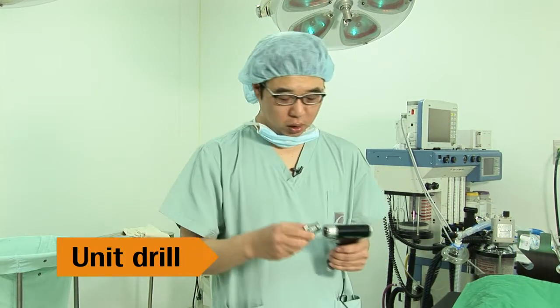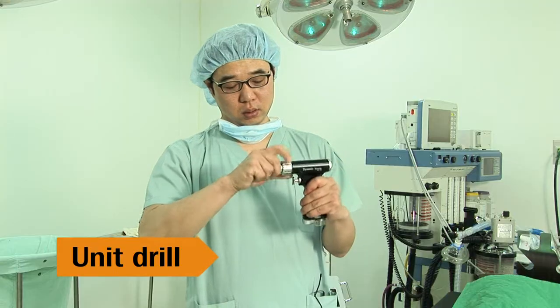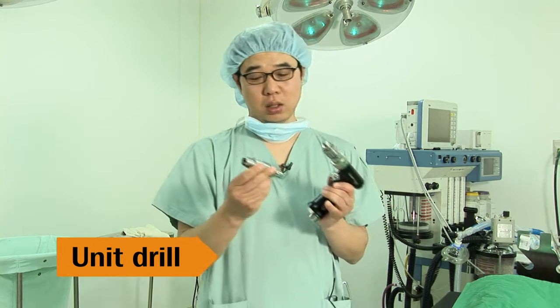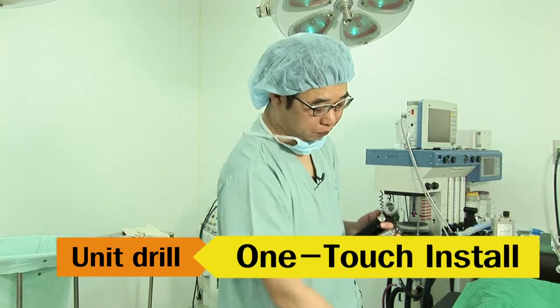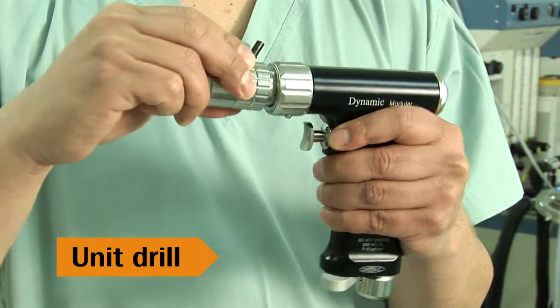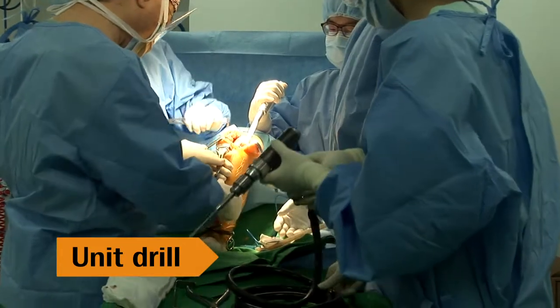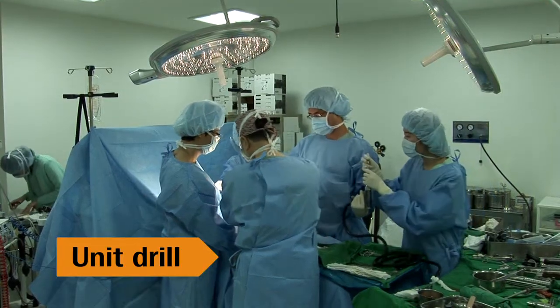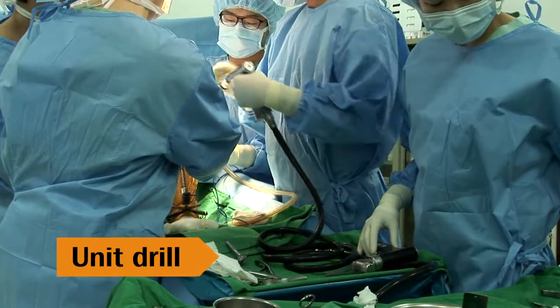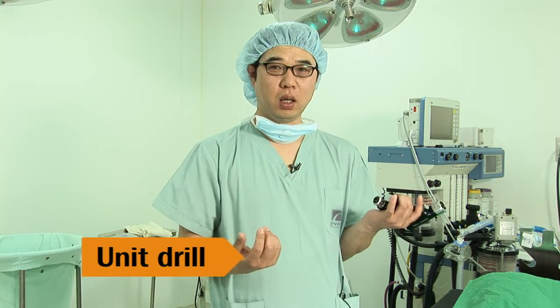For both the drill and reamer, it's very easy to attach and separate with the one-touch function. This product also has excellent power transmission when in use. The reamer tends to move forward when perforating the bone due to its ballast. The thing I liked most was that the connecting part of the hose is compatible with Linvotec products, so you don't need to purchase any separate accessories.